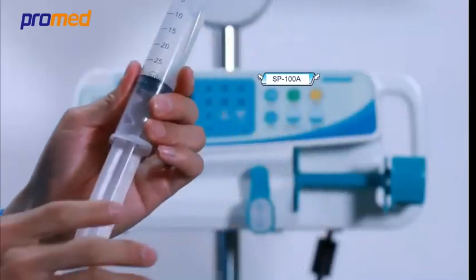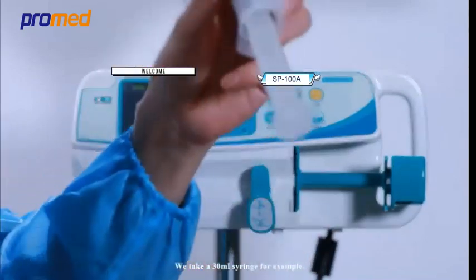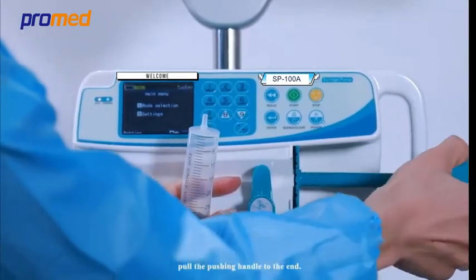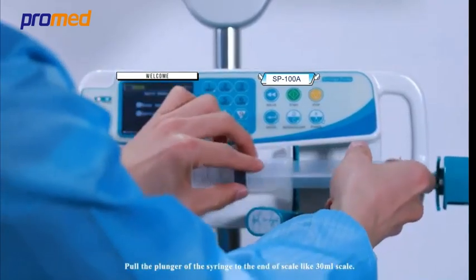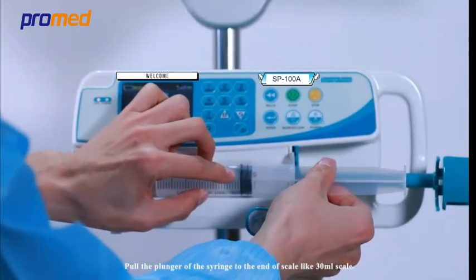To calibrate the syringe pump, we take a 30 milliliter syringe for example. Hold and press the clutch, hold the pushing handle to the end, hold the syringe holder to the end and rotate 90 degrees rightward. Pull the plunger of the syringe to the end of the scale, like the 30 milliliter scale.